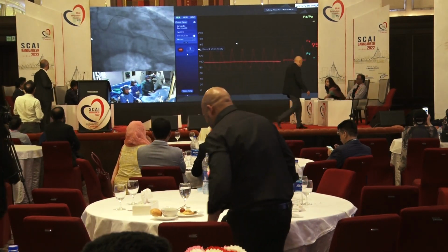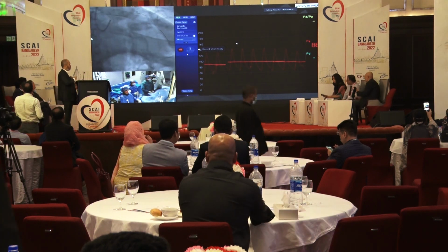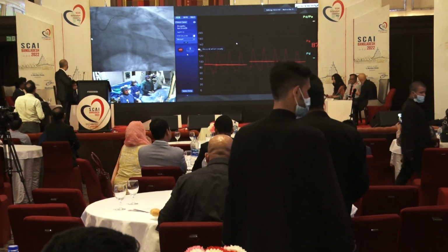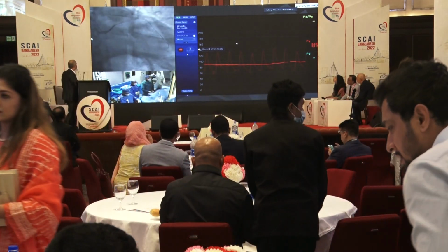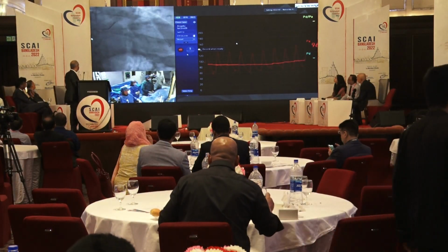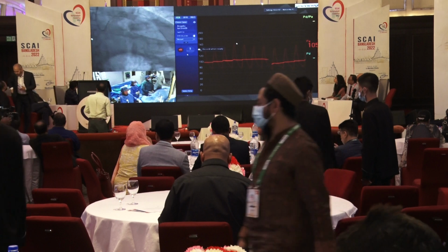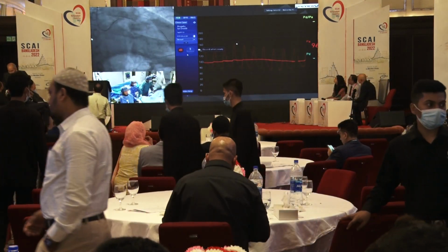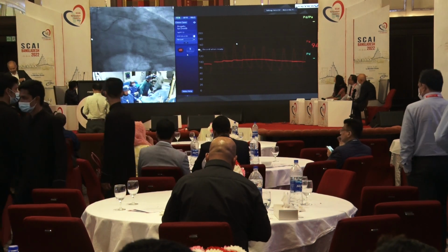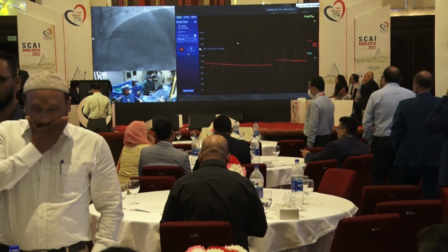But in general, the distal part is the one that I would treat first, and I would dilate with the balloon, and then decide according to the result whether to do stenting or drug-coated balloon, because I prefer, if I can, not to implant a long stent on the LAD.